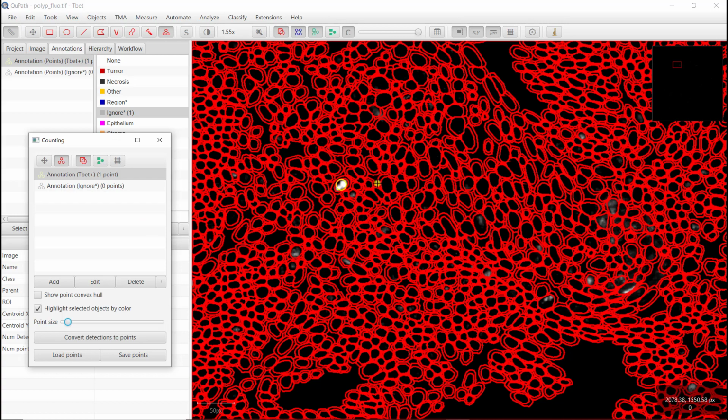What is taken into account by the classifier is where you click. At that point, it knows that it's inside this cell, so that's for this cell. So you can define a few examples. What is important is to have something representative. So this one is fainter, but I think it's true.